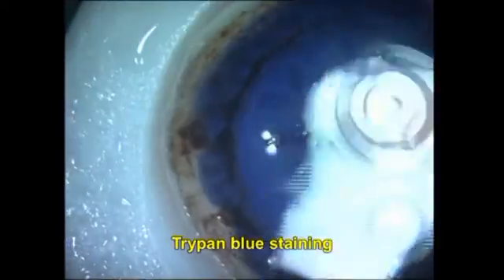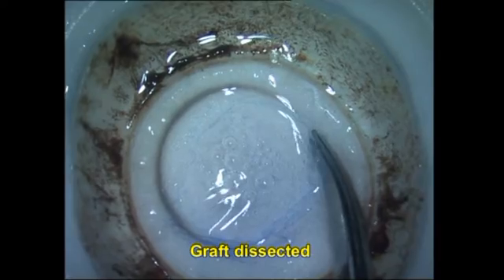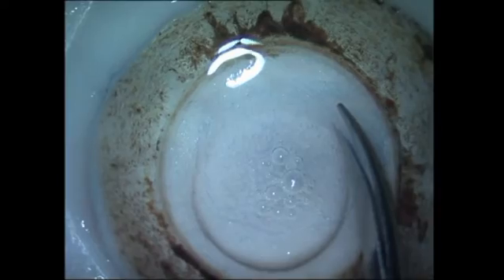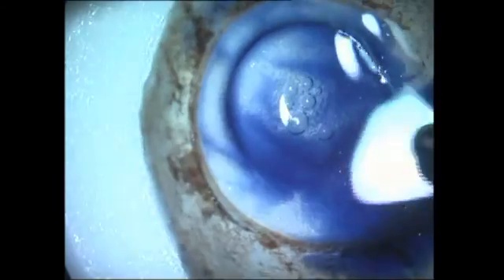I go ahead and use a sideport blade to decompress both the type 1 and type 2 big bubbles, and then slowly trephine the graft using a sharp trephine. There are some undissected bits unfortunately because of the spongy nature of the cornea below, and these are gently cut — making sure to leave no tags — with Vannas scissors.